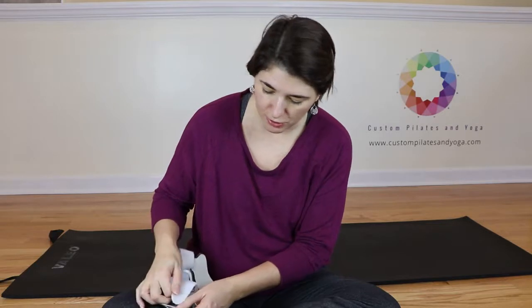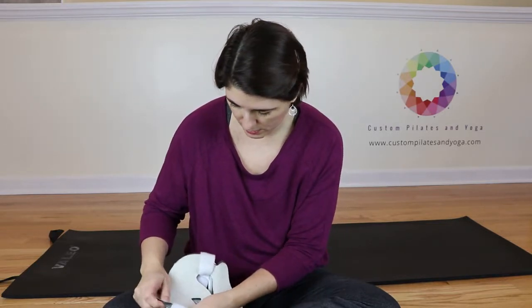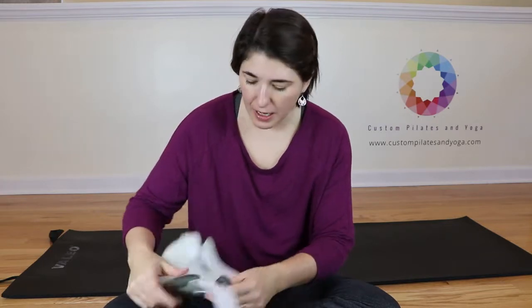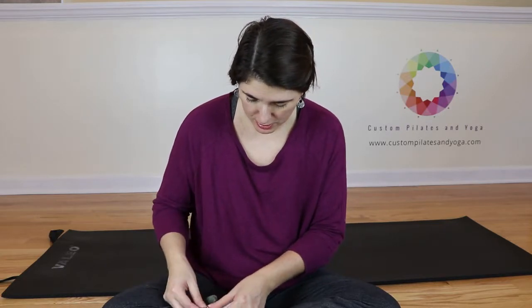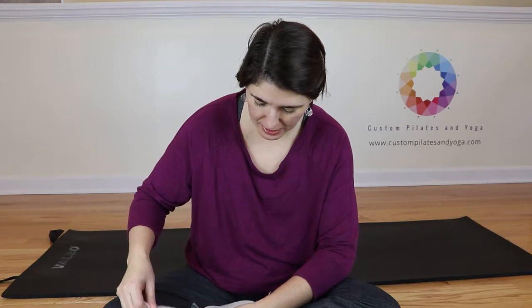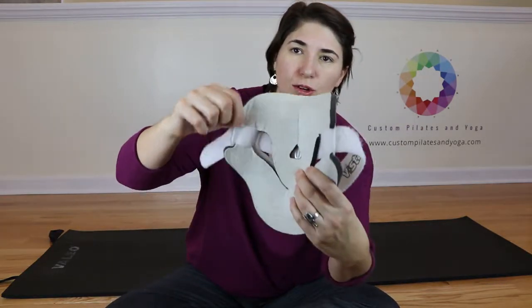And then you're going to lace it through and tighten up. Now on the corners, make sure that this strap sort of goes through that notch that they've provided.